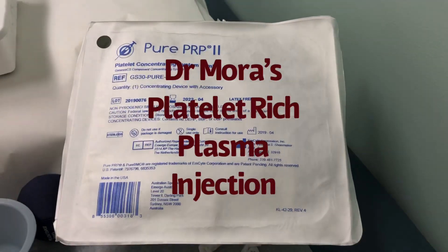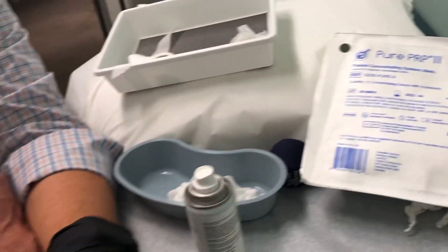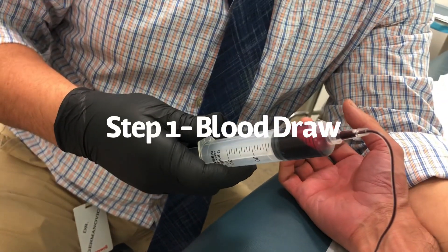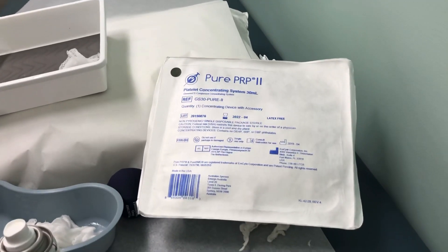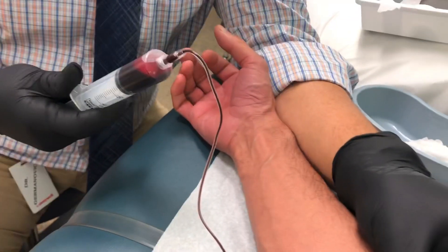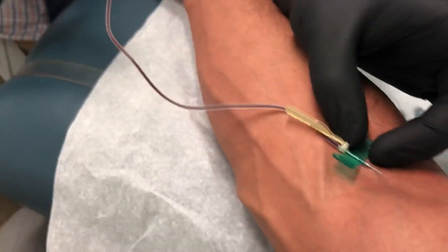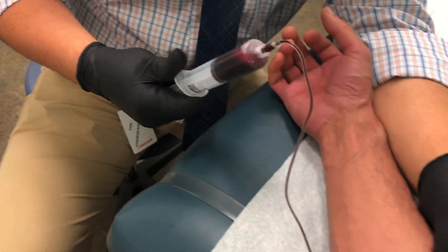We're doing an M-Site PRP injection today. We're drawing a 30cc blood sample and we're going to take this 30cc, put it through the M-Site double spin system, concentrate the platelets and about three cc's of plasma, and inject them into my right knee. This is step number one — the blood draw. As you can see, I'm a very vascular person.